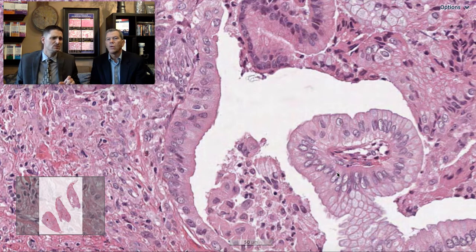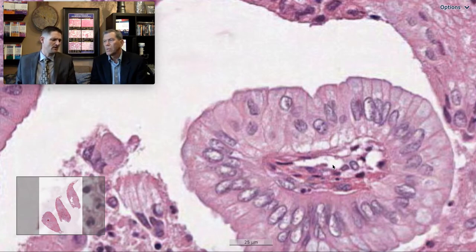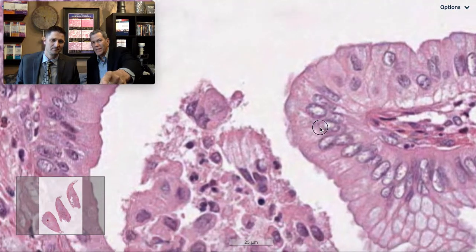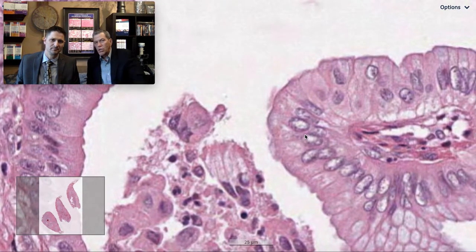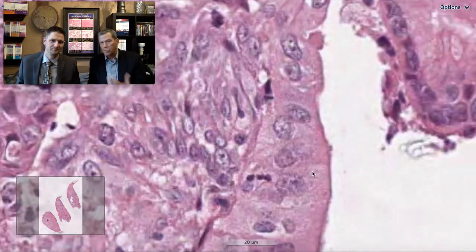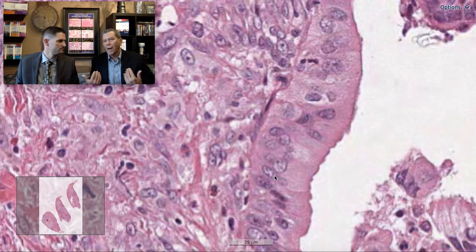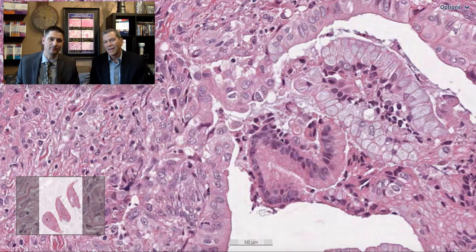Cytologically, most peribronchiolar metaplasia retains a very nice degree of polarity — the nuclei are basally oriented. But what is that cell doing there? And look to the left: there's a goblet cell with a very long column of cytoplasm — look at the size of that nucleus at the base compared to these monsters. When you're surrounded by big nuclei, it's hard to have perspective, so the contrast when you have them next to each other is dramatic. Also my general rule: no more than three mucinous cells in a row.